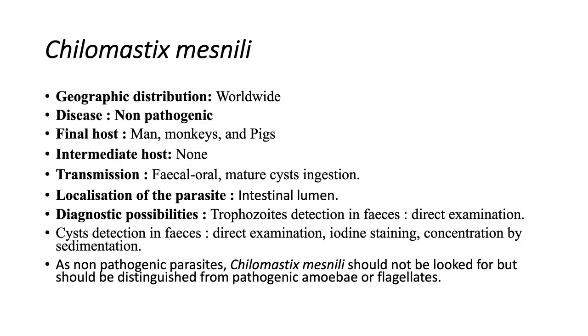The transmission is the same, fecal oral route or by mature cyst ingestion. Localization of the parasite is like the other amoeba, intestinal lumen, and the diagnostic possibilities are the same, trophozoite and cyst by direct examination, okay, under the microscope. And here it's non-pathogenic, right?